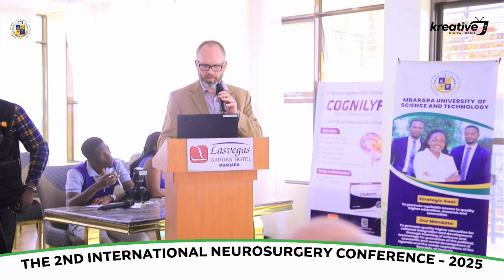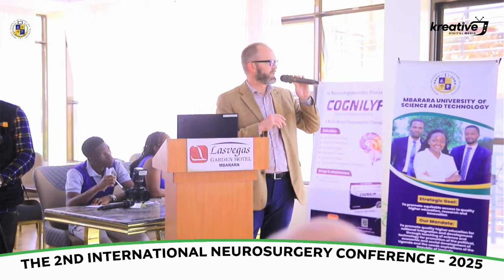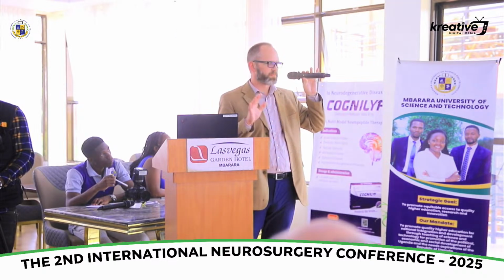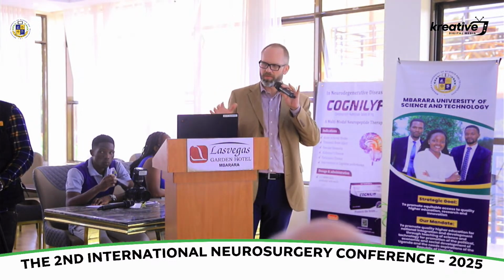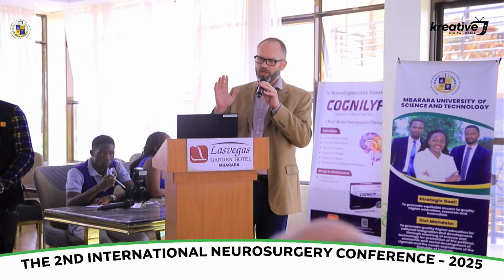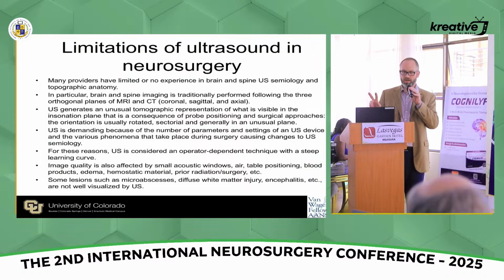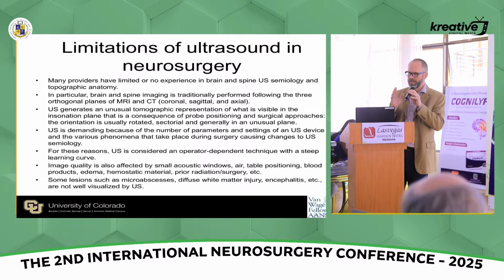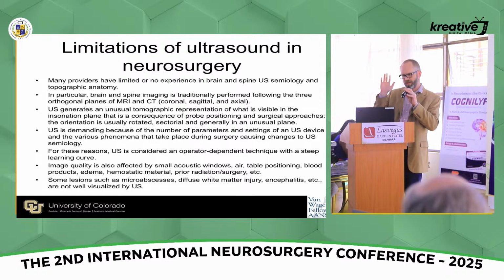So the second point is that most neurosurgeons are familiar with MRI and CT, where we get orthogonal planes. We look at axial, sagittal, and coronal views. In an operative case, you get two orthogonal views with each exposure. It can be different. In the spine, it's axial and sagittal. On a pterional, it's an axial and a coronal. But you can also get oblique views.